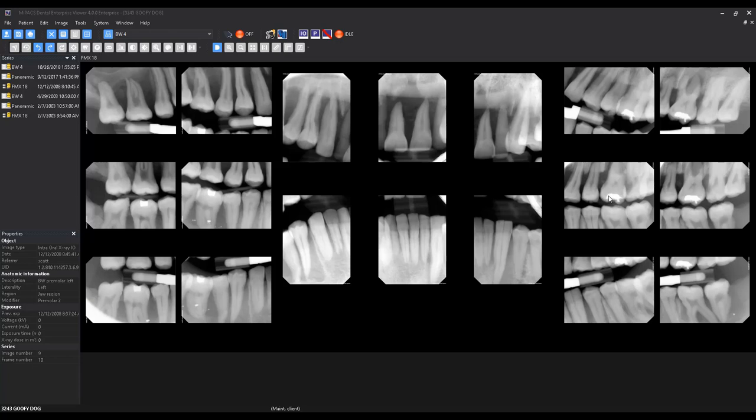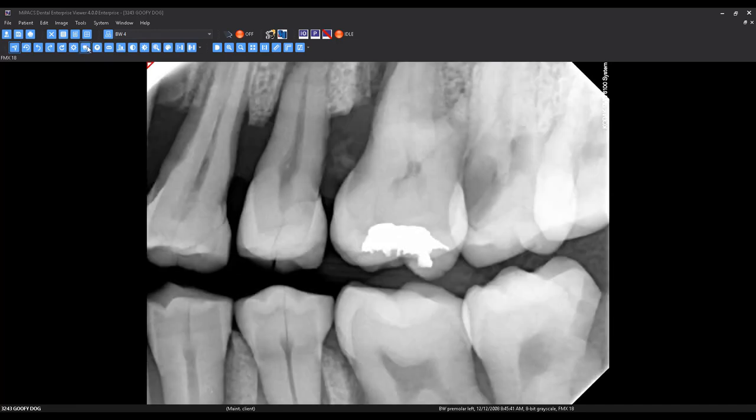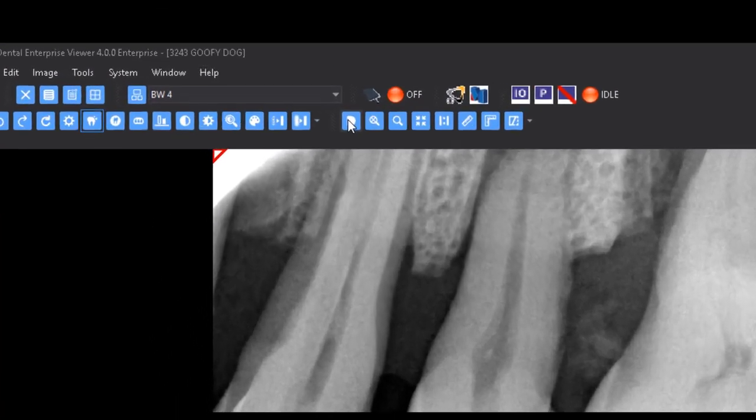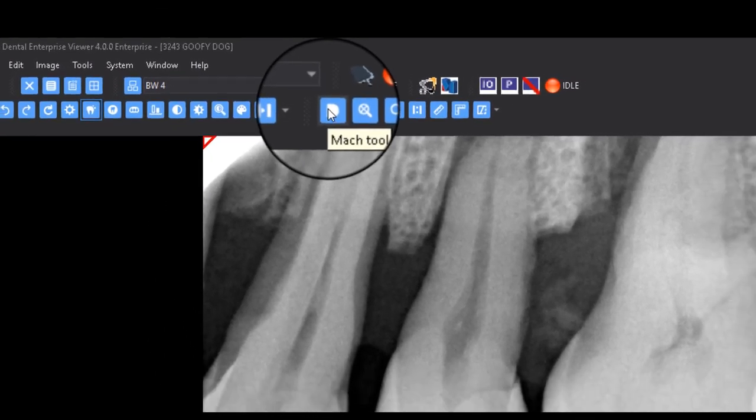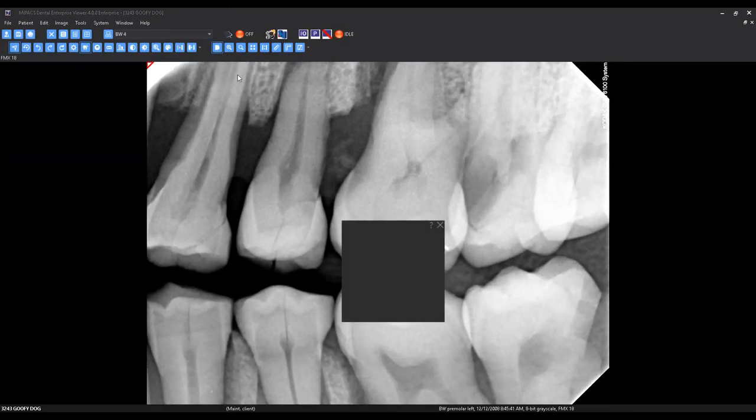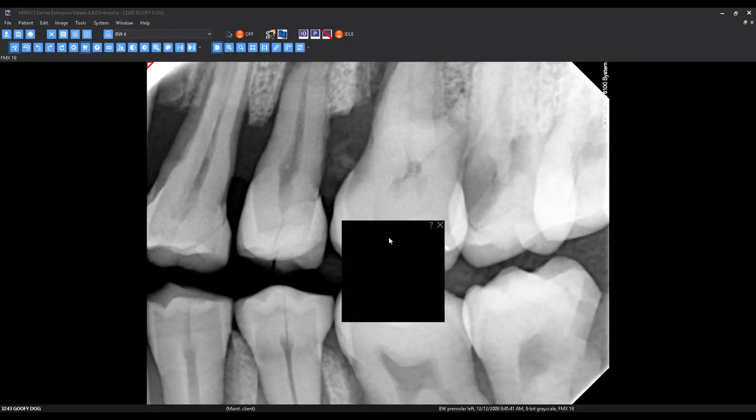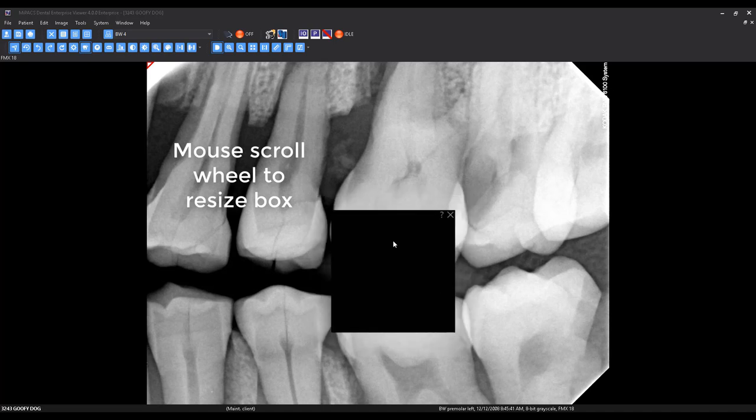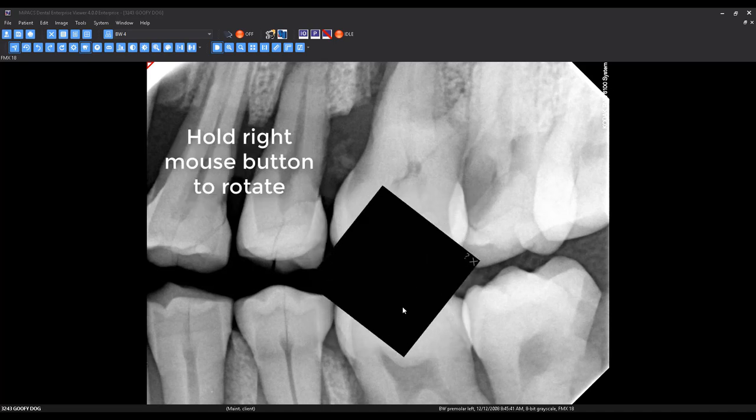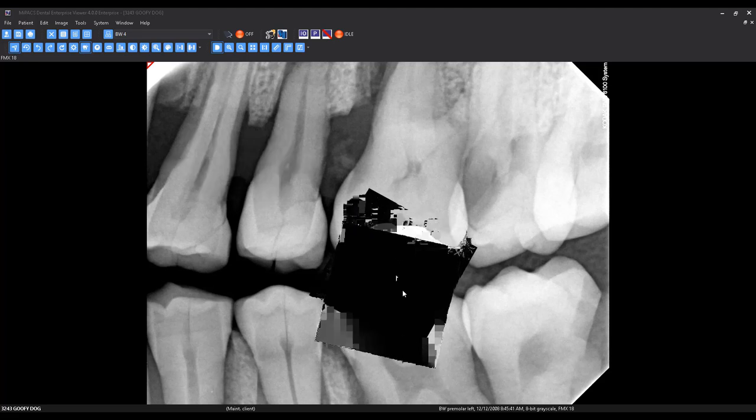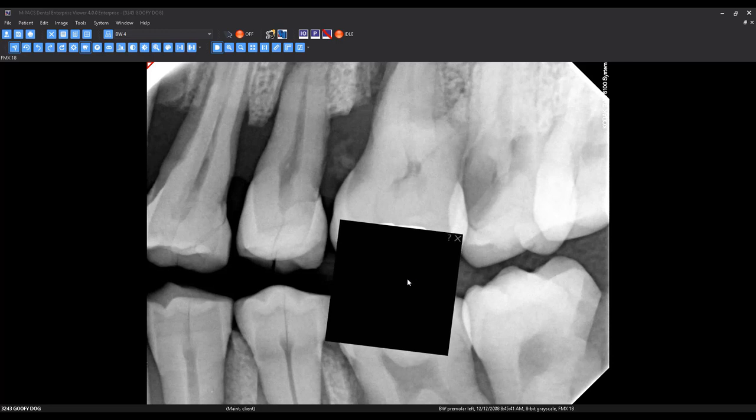For optimal results, the black square in the Mach effect correction tool should be angled parallel to the edge of the object and sized accordingly to cover it up. To use the Mach effect tool, select the Mach effect button from the toolbar. This will display the Mach effect dialog, which you can place anywhere on the image to help with diagnosis. You can adjust the size of the Mach effect tool using the scroll wheel on your mouse. You can also adjust the rotation of the Mach effect tool by holding the right mouse button down.